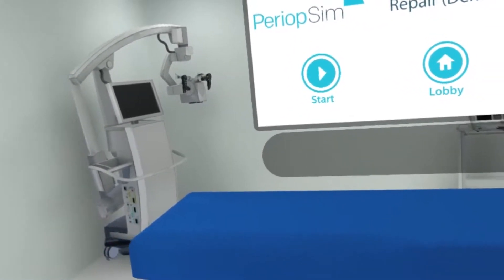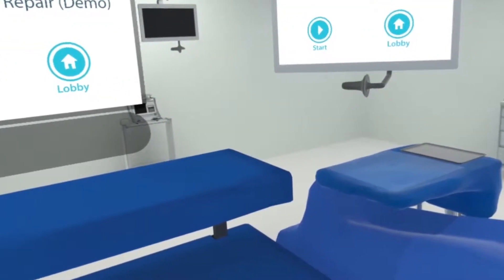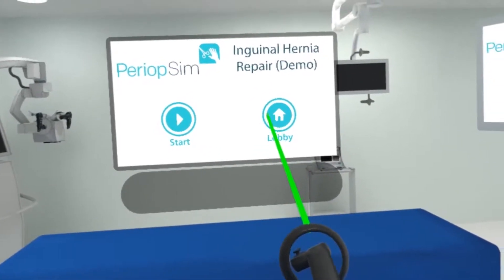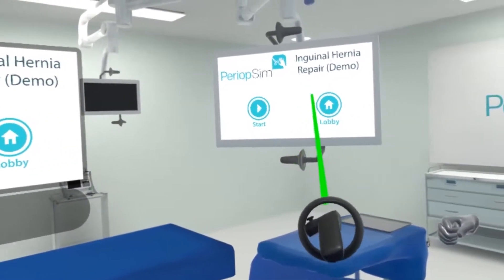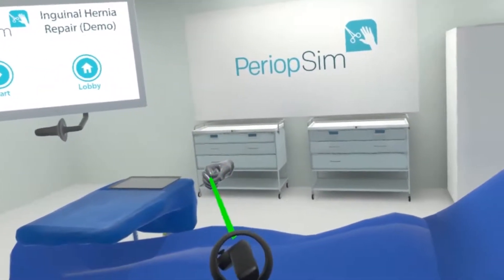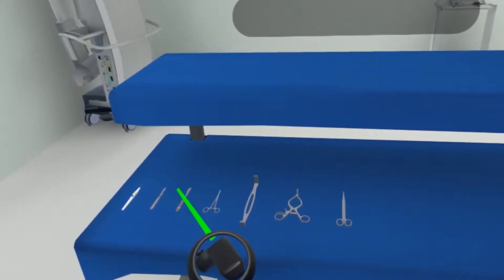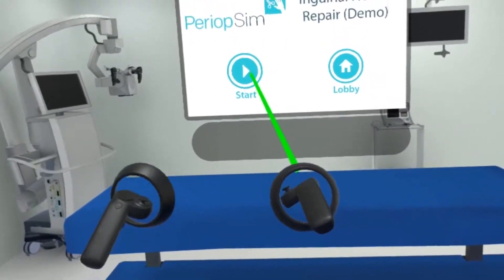First I'm going to orient you to the operating room. If I'm taking a look around, I can see the back table here. I've got the screens up here where I can do some navigation. I've got the surgeon hand, the neutral zone for sharp zone safety, and the Mayo stand. I am going to start now.